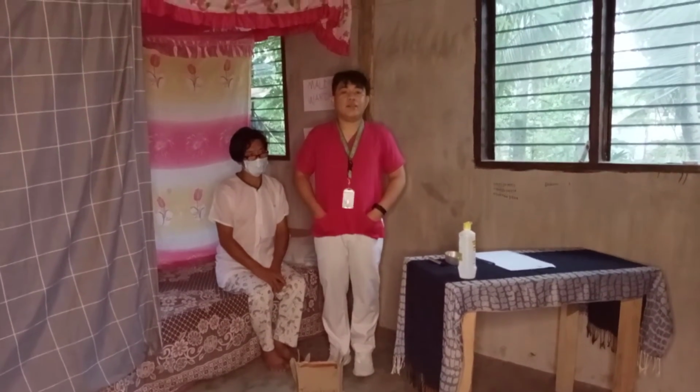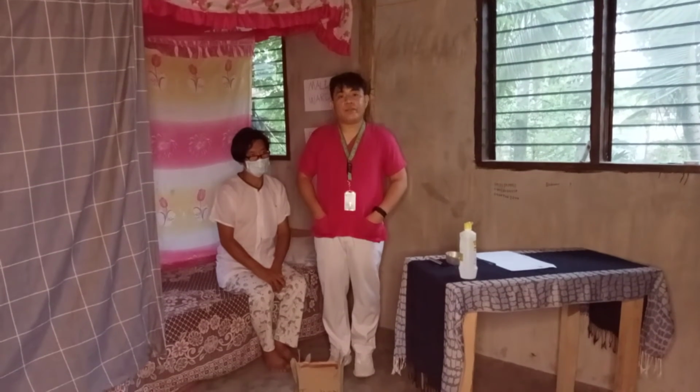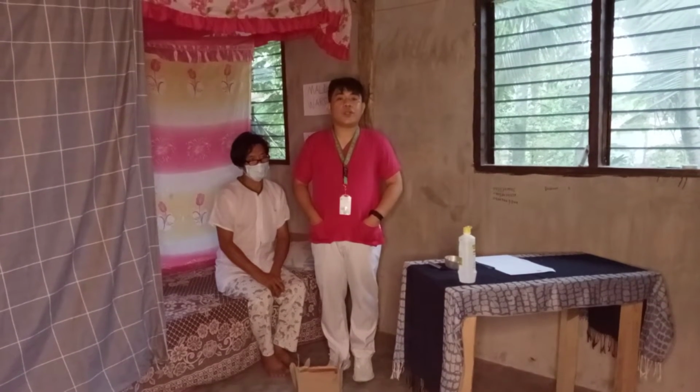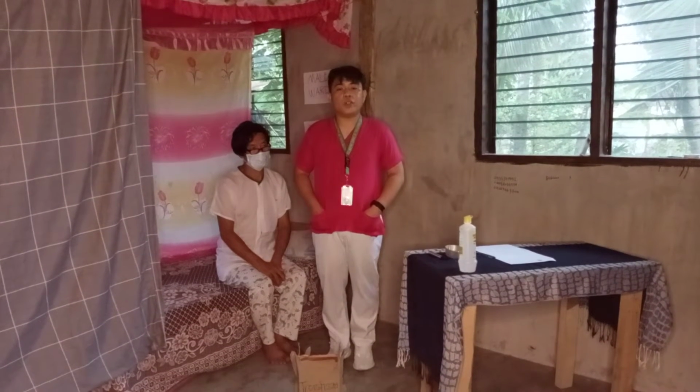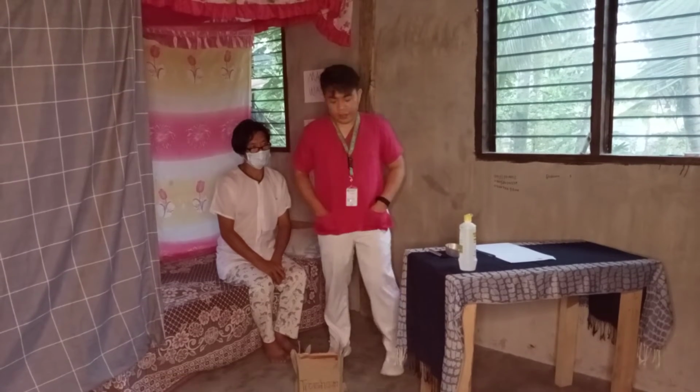First, identify and explain the procedure to the patient. Rationale: to ensure correct procedure to the right patient. Explaining the procedure reduces anxiety and fear, thus promoting cooperation from the client.